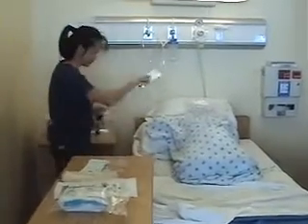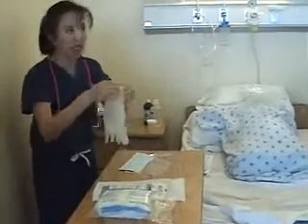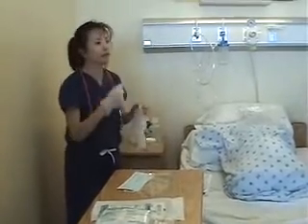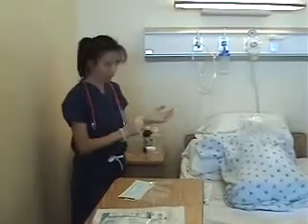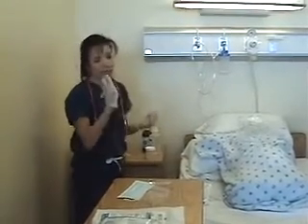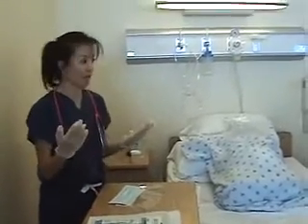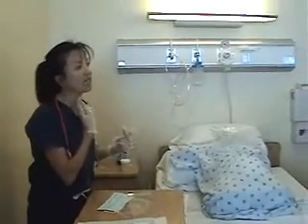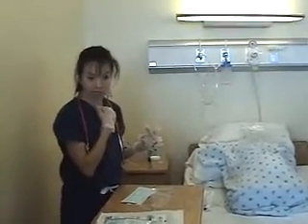So you want to do suctioning with the mask. Okay, you've all been to the dentist, right? What do you think is the best way for the dentist to do the suctioning of your mouth? Mucosa, exactly. You come into the cheek, you don't go directly in here. That's why we say that you do not have a loss of reflex, right? Nobody should be sticking anything in under here for you, so that's going to really hurt you, right? Because our reflex is intact, correct?